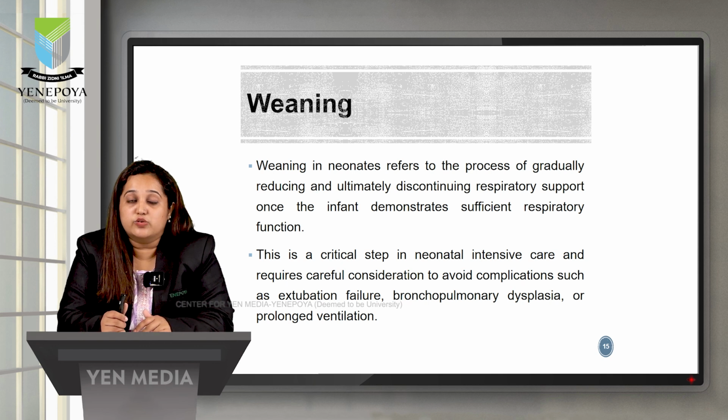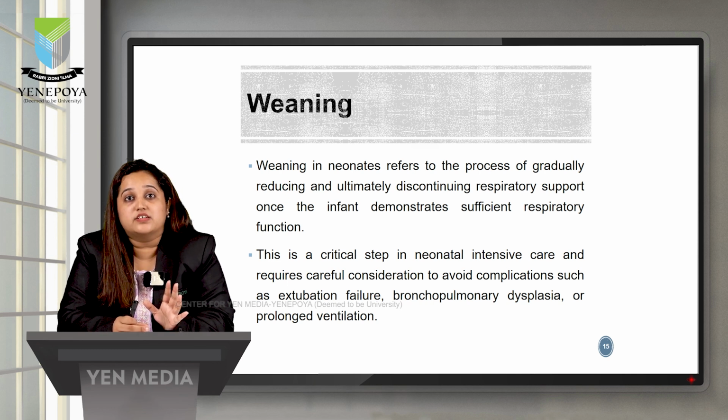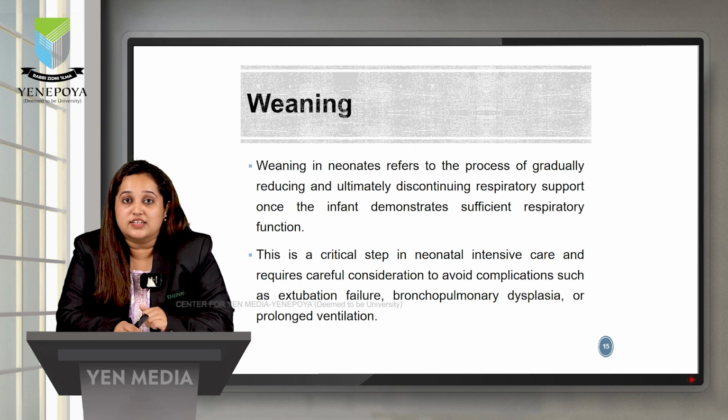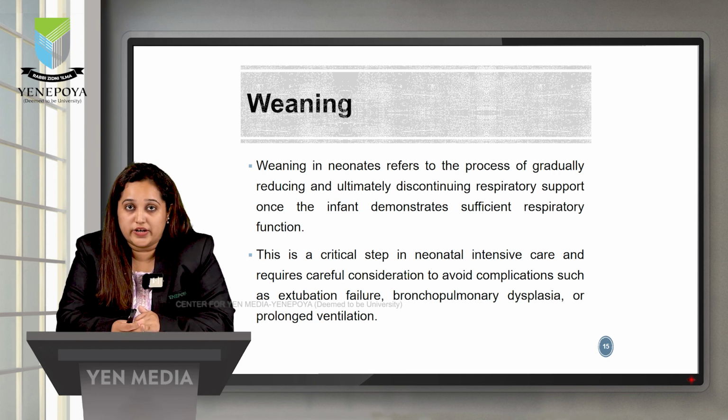So weaning in neonates refers to the process of gradually reducing and ultimately discontinuing the respiratory support once the infant demonstrates sufficient respiratory function. This is a very critical step in an ICU and requires careful consideration to avoid complications such as extubation failure, bronchopulmonary dysplasia, or prolonged ventilation.